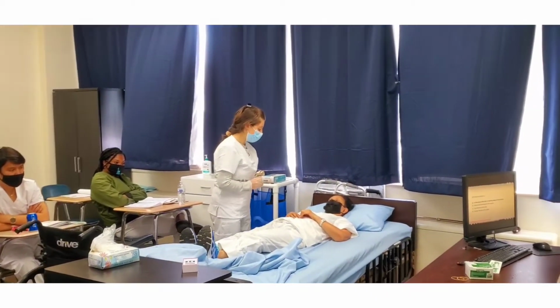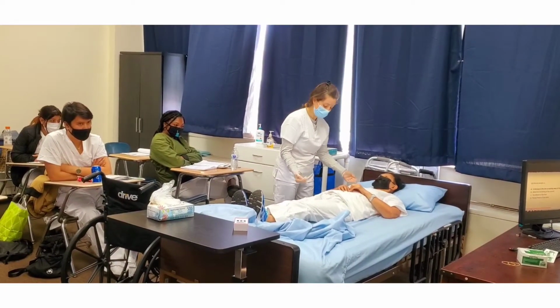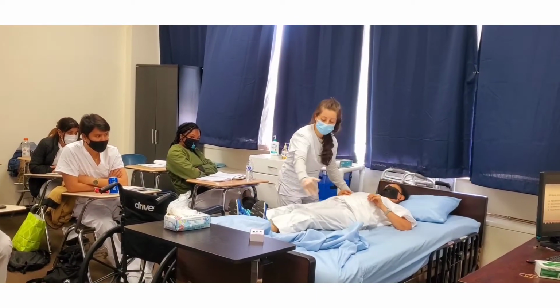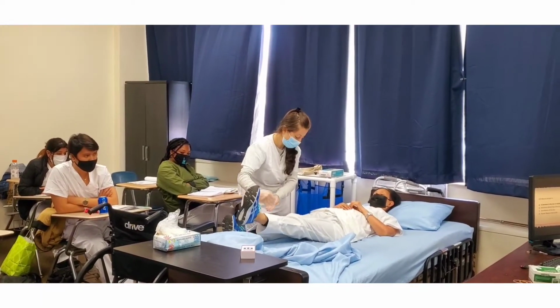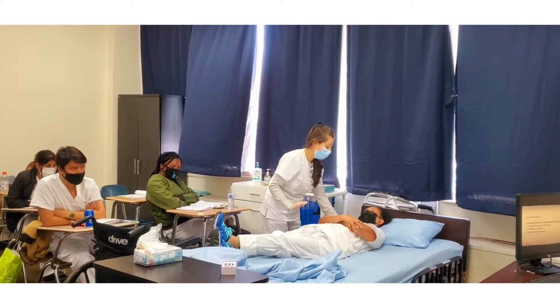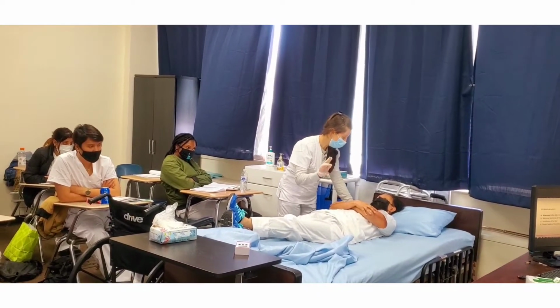So Ms. Carpio, on the count of three, I'm going to gently raise you and get you closer to me. One, two, three. Cross her legs, cross her arms for proper body alignment. Cross your legs. Cross your arms. On a count of three, you're going to get her in a sitting position. One, two, three.